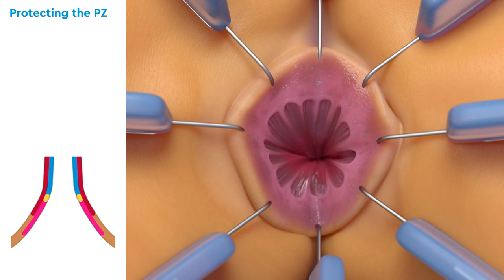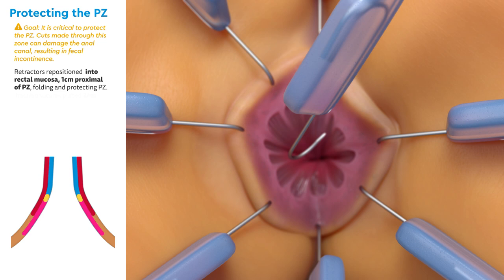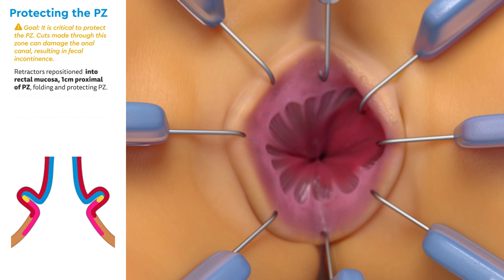Protecting the pectinate zone is critical to this operation. Cuts made within this zone will damage the anal canal, resulting in fecal incontinence. The retractors are repositioned into the rectal mucosa one centimeter proximal of the pectinate zone. This folds the pectinate zone under the retractors, protecting it for the duration of the operation.